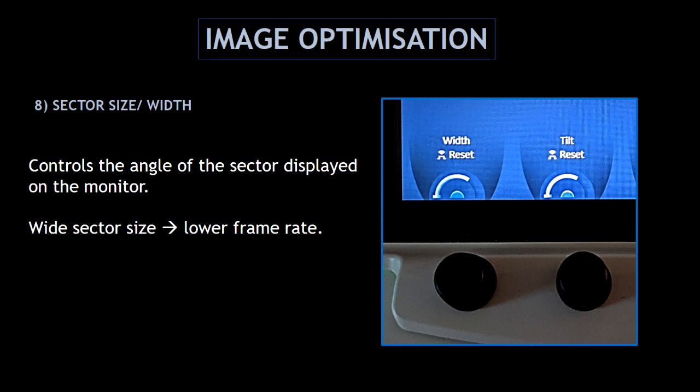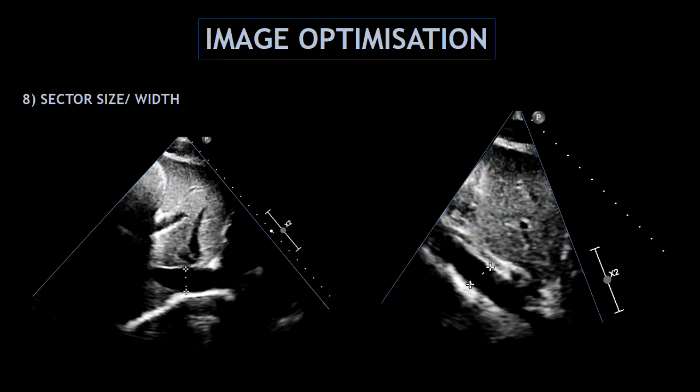Another feature to optimize the image is the sector size or width. This controls the angle of the sector displayed on the monitor. The wider the sector size, the lower the frame rate, affecting image quality. We can normally find these features on the lower part of the screen. Here I'm showing how I adjust the sector size during the scan — on the left side, I'm measuring the inferior vena cava and I like to increase the sector size; on the right side, I'm measuring the diameter of the abdominal aorta and I like to decrease the sector size.